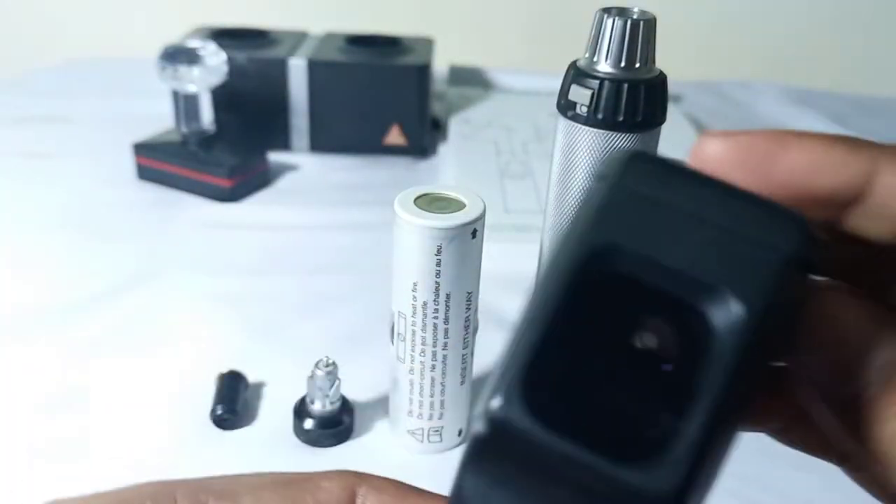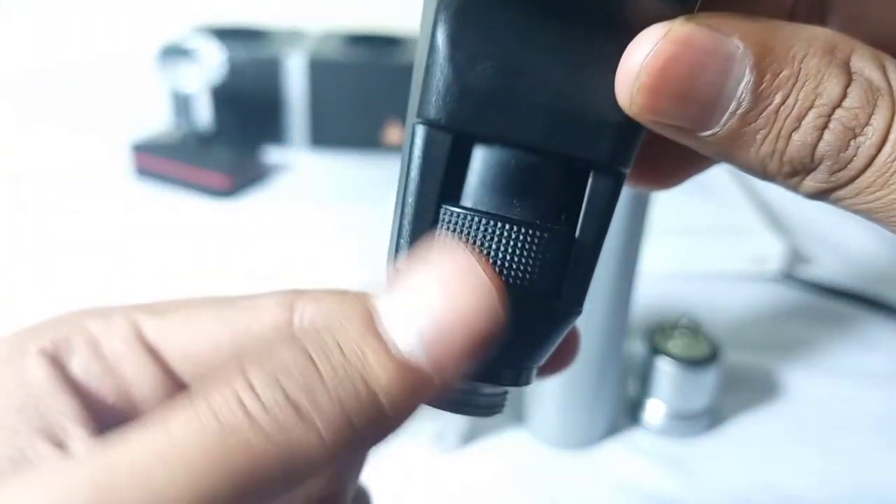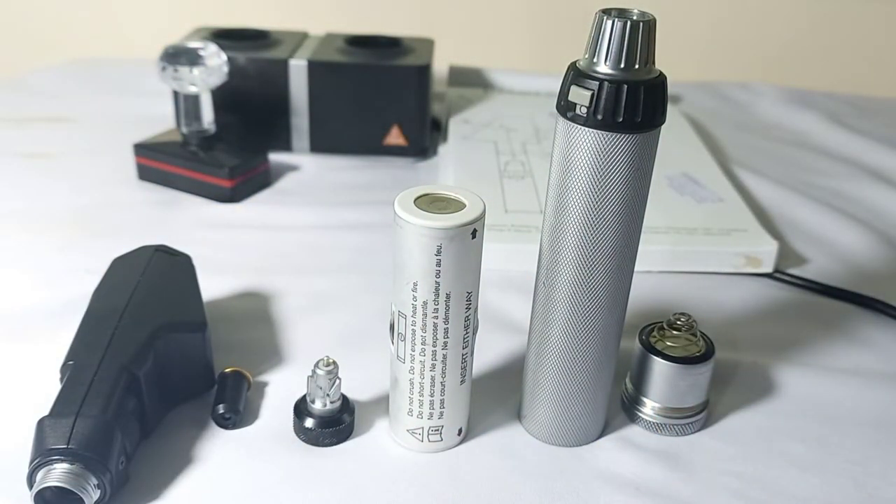The most important part is this — it is called the head of the retinoscope, and this is the neck of the retinoscope. Now we will fix all these together.